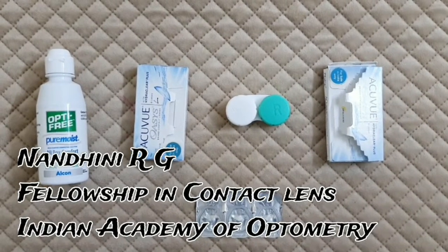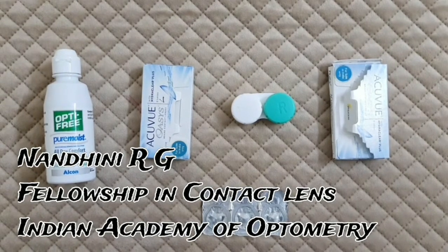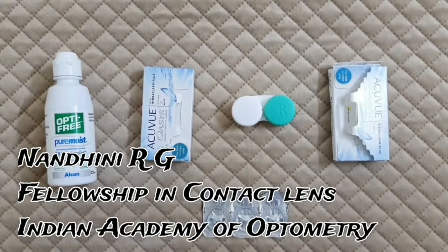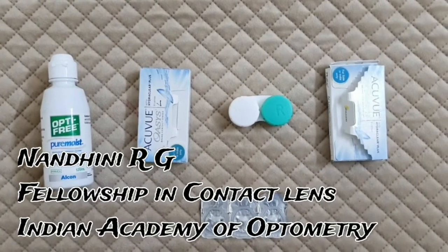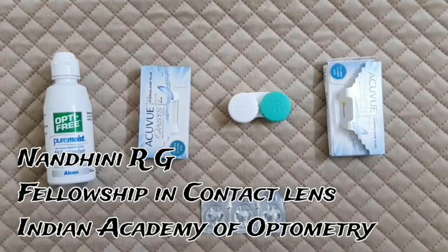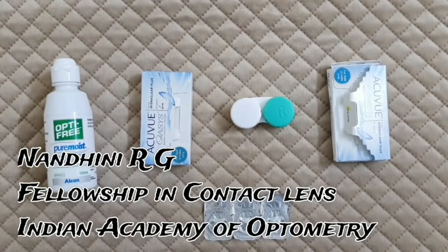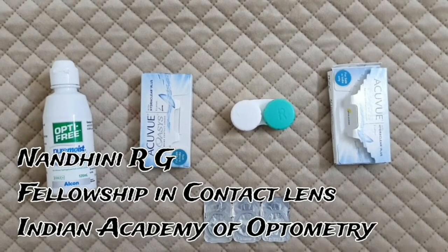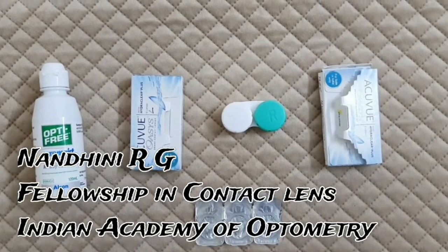Hi all, I am Nandini, pursuing a fellowship in contact lenses at the Indian Academy of Optometry. In this video, I am going to show you how to insert and remove contact lenses. There are three steps: the first step is cleansing your hands, the second is how to insert, and the third is how to remove the contact lenses.